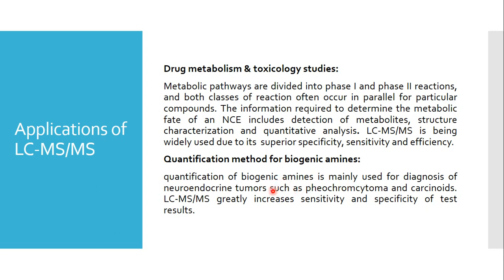So in conditions like pheochromocytoma and carcinoids, the quantification of these biogenic amines is important. This can be achieved with the help of LC-MS. It greatly increases the sensitivity as well as specificity of the test results.